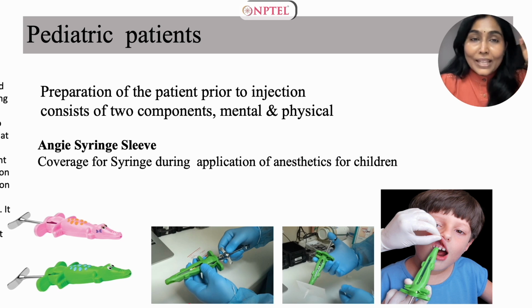There is a debate among clinicians as to whether the syringe and its components should be assembled in view or out of view of the patient. Proponents of assembling the syringe in view of the patient assert that doing so acts as a desensitization technique, while proponents of assembling the syringe out of the patient's sight assert that most children have developed a fear of the injection during prior visits. So it is preferable to assemble the syringe out of sight.